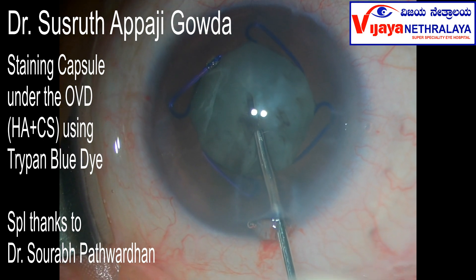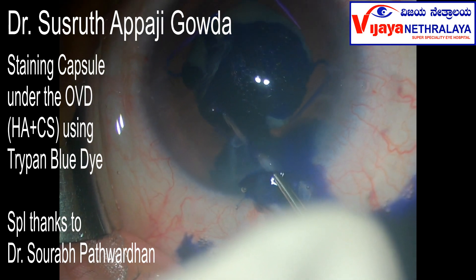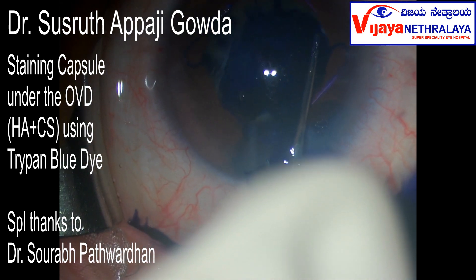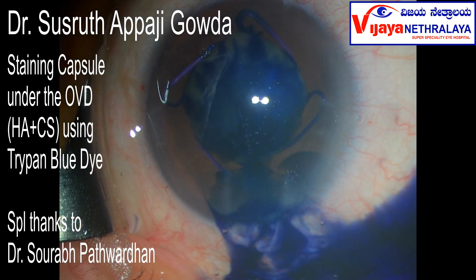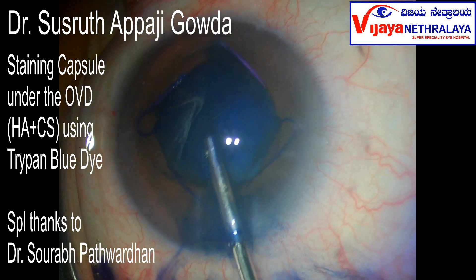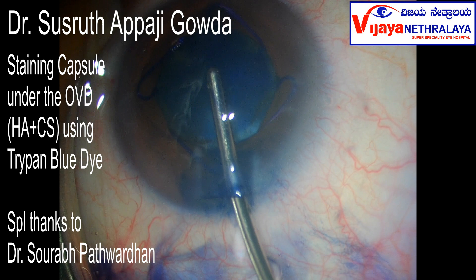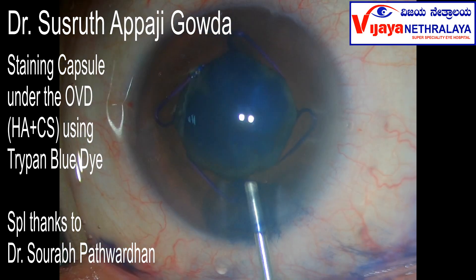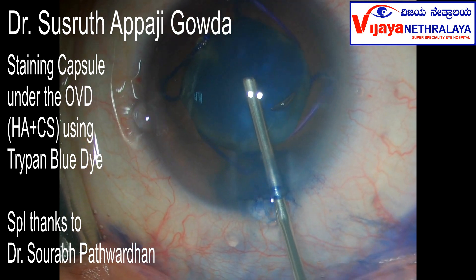It is not possible to stain the anterior lens capsule after injecting HPMC, but it is possible to stain the anterior lens capsule when we use hyaluronic acid and chondroitin sulfate in this manner. Go as close as possible to the capsule and inject just under the OVD. This is then washed. Now inject some more OVD — this time HPMC.